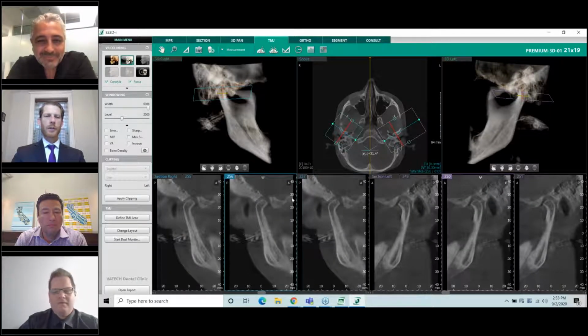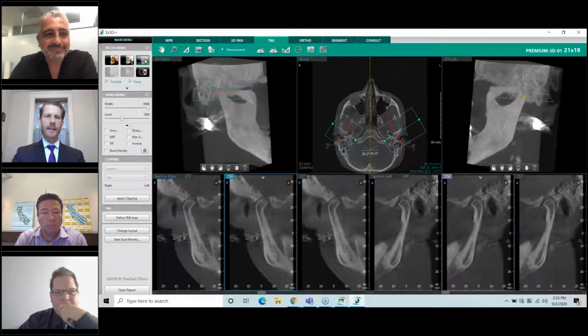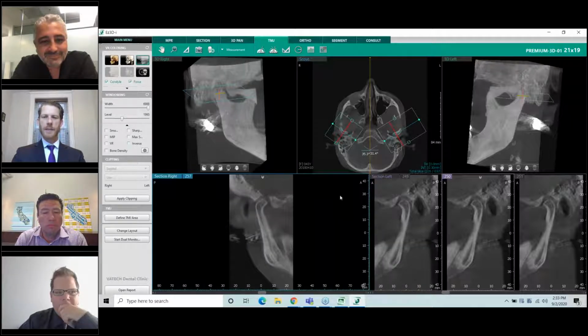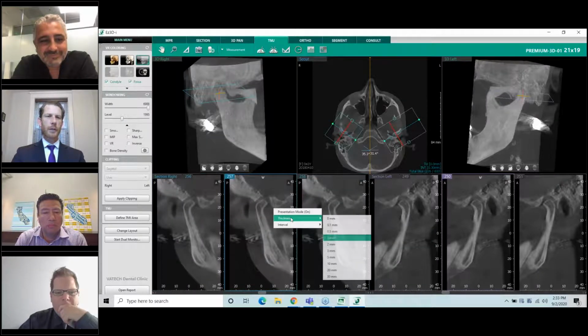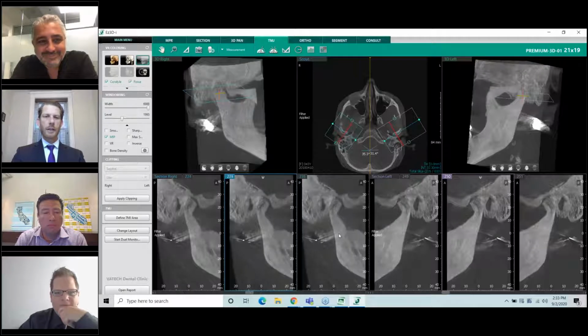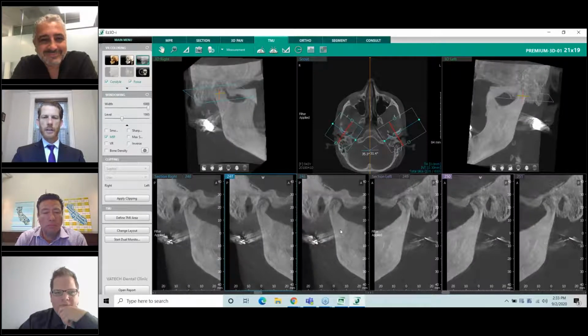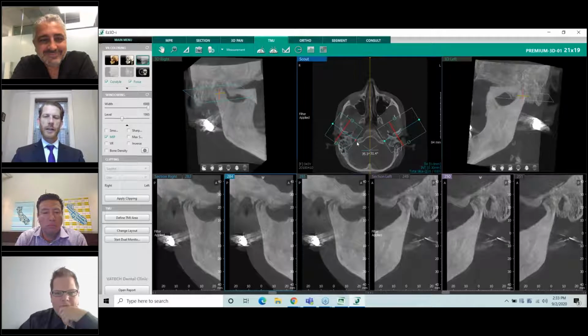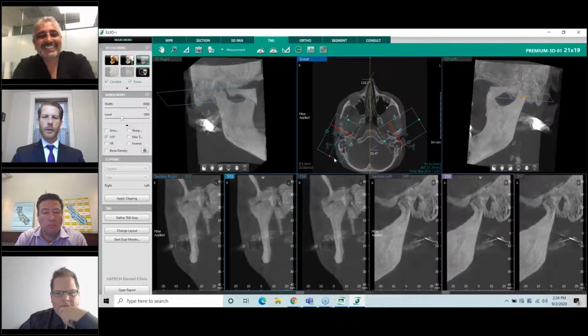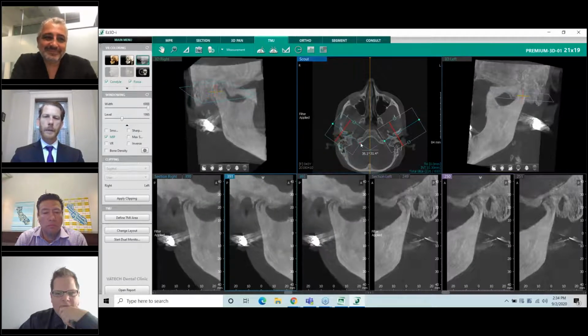I think, yeah, with the TMJ window, you can go through and change your opacities. You can change it to the MIP to get more of that slab view that we talked about with Dr. Miles, adding that thickness on there. So go over to your windowing. Yeah, maybe change that up to 10 or 20. And then go to your windowing over to the left and change it to MIP. And that's really going to give that lateral medial view of that condylar head. Right. And then you do your diagnosis, which Dr. Ataii is going to talk more about, like I said, on the next webinar, and really get into more of the clinical data and aspects of what we're looking for on the medial pole or different things like that. Yep. Got it.